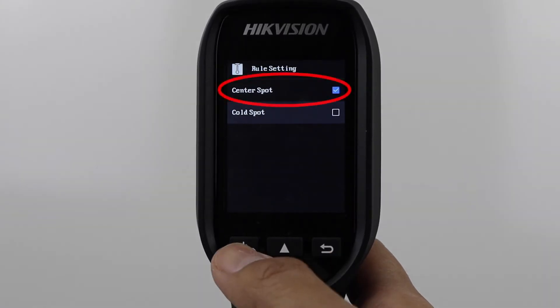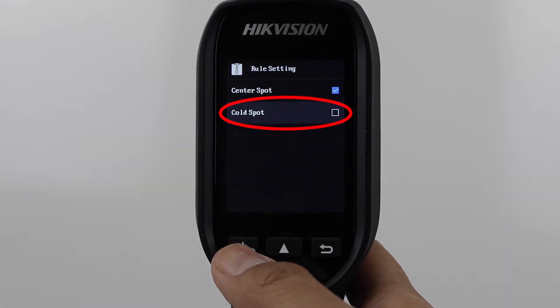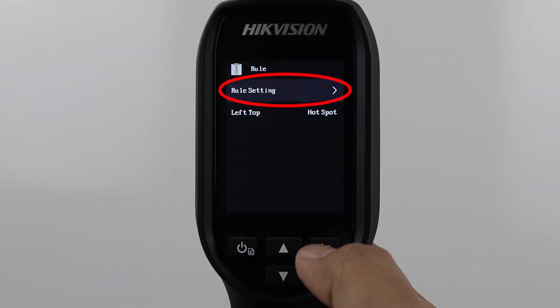In this case, use Center Spot instead. This will measure whatever is in the center of the device's crosshair. Cold Spot should not be used for body temperature, as this will locate and measure the coldest spot in the scene. Use the Rule setting menu option to change the measurement rule.